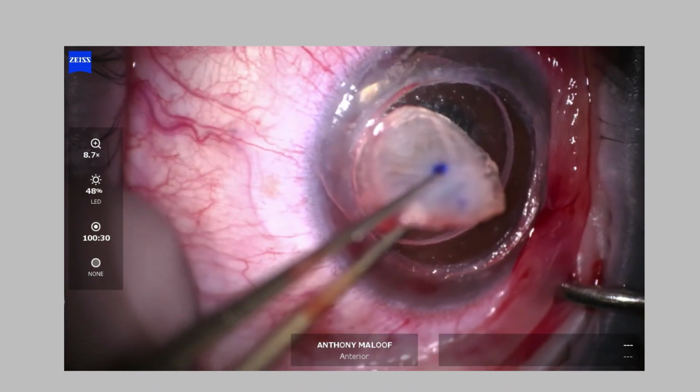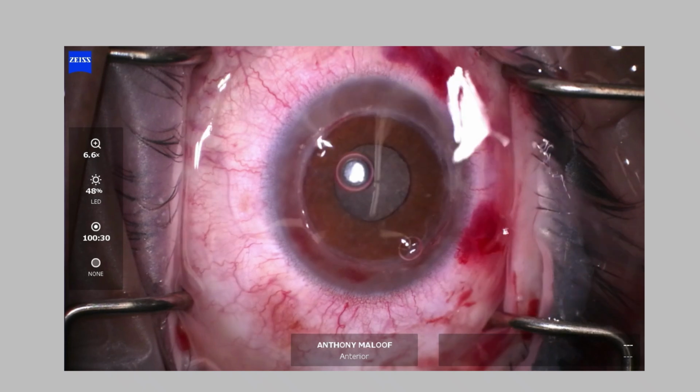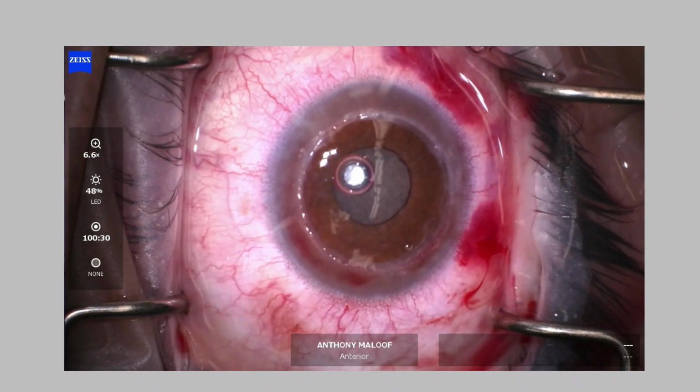Cornea comes off. I always send it to pathology even though we know it's macular dystrophy. Patient likes to see a pretty picture. You can clear up anything centrally. I use the little red blade to do that.